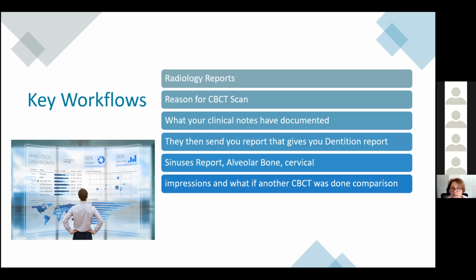And then your billing becomes separated. Your billing for taking the film, taking the scan. I keep saying it's a film, taking the scan. And the radiologist for reading it is actually going to help you bill for the impression, the written report.